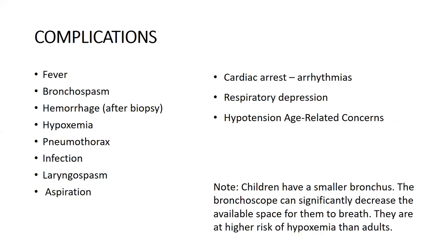The complications after performing the procedure are fever and bronchospasm, hemorrhage if a biopsy is taken, hypoxia, pneumothorax if deep biopsy specimens are taken, infection, laryngospasm, chances of aspiration, and cardiac events like arrhythmias, respiratory depression, and hypotension. Children are at higher risk of developing hypoxia than adults because they have smaller bronchi. The bronchoscope can significantly decrease the available space for them to breathe.